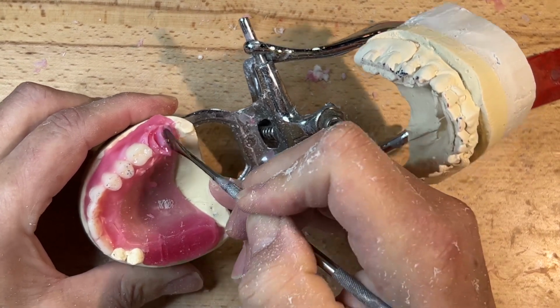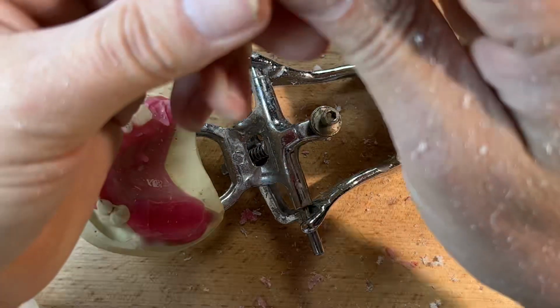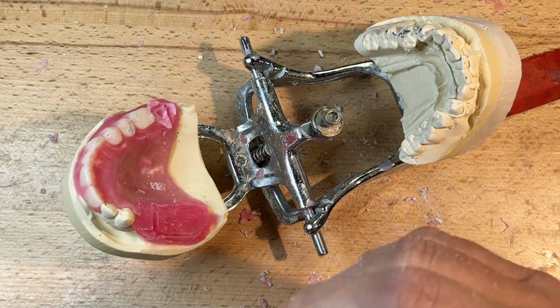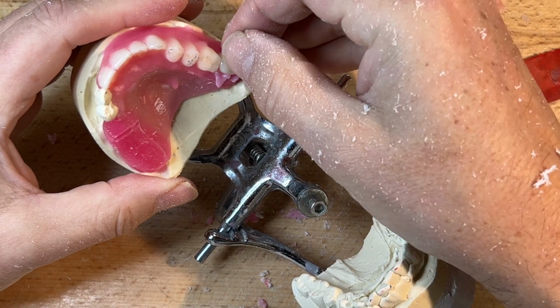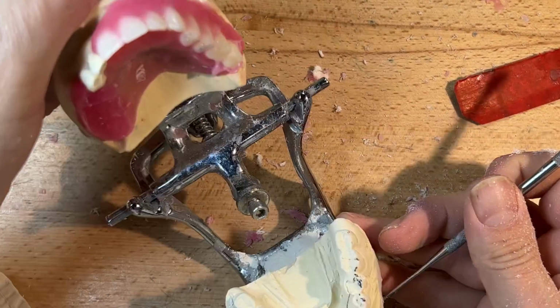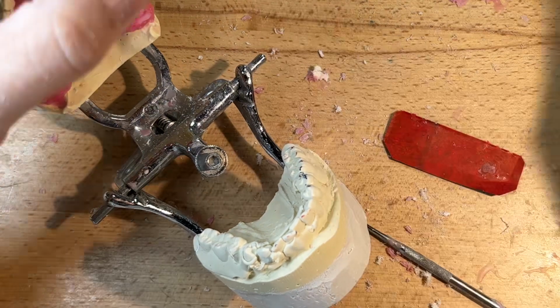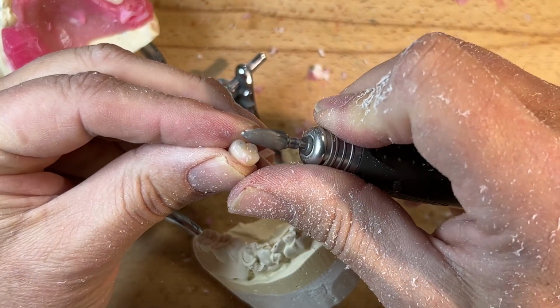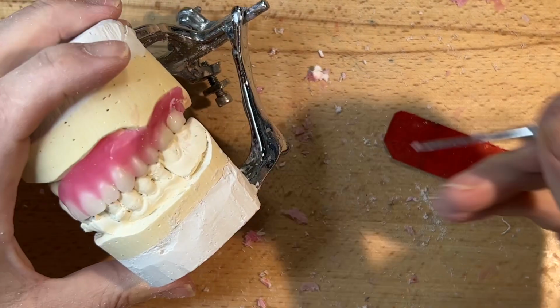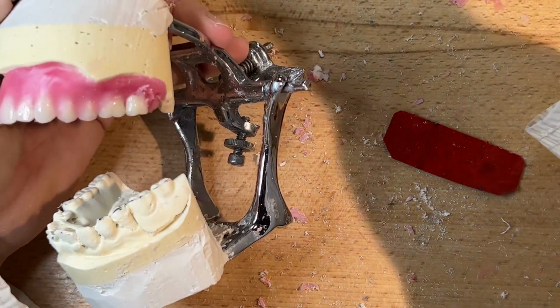Soften the wax again. You can kind of see here from experience if you need to reduce the tooth structure. I'm going to take a little bit on the ridge lap, a little bit on the ridge lap. Also increasing, when there's processing time, tooth surface area for bonding to the acrylic denture base. Again, this one is not necessary to reduce too much occlusal surface, if any, at all. But you know what? I will take just a touch to widen the occlusal tip a bit there. And those 2 inclined planes, just a touch. And there we have this whole quadrant now completed.